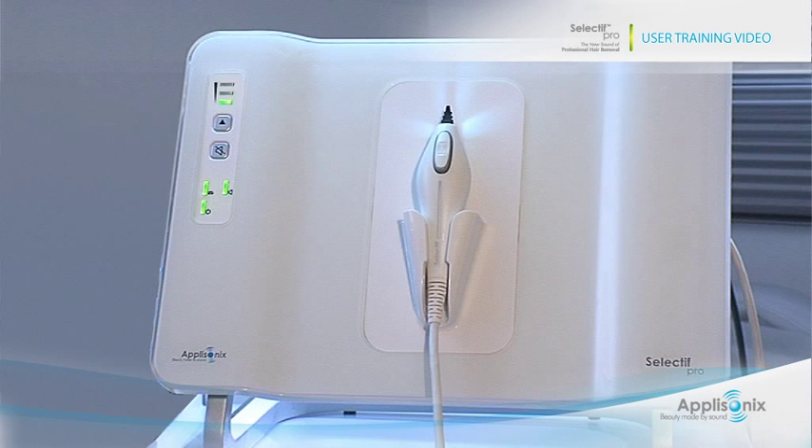Remember, the Selectif Pro system is easy to use and highly effective when used and maintained properly. We hope you will enjoy your Selectif Pro system for many years to come.